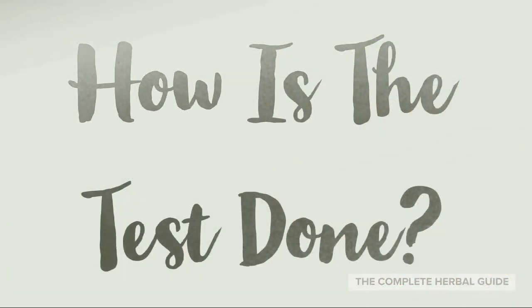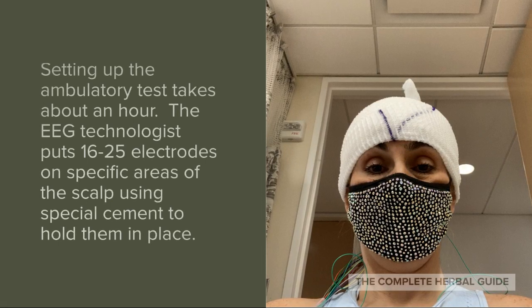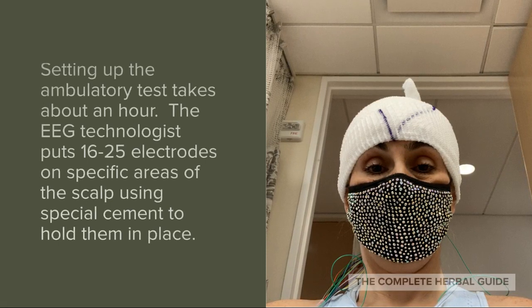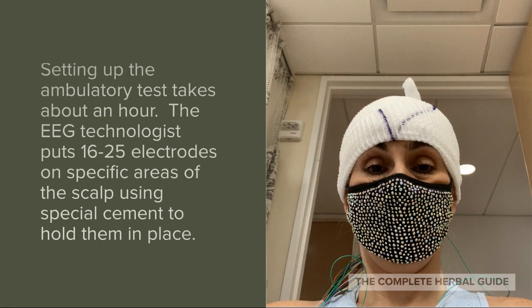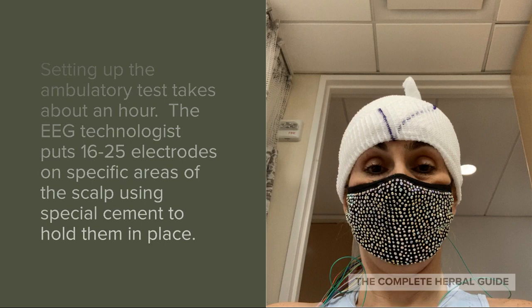How is the test done? Setting up the ambulatory test takes about an hour. The EEG technologist puts 16 to 25 electrodes on specific areas of the scalp using special cement to hold them in place.